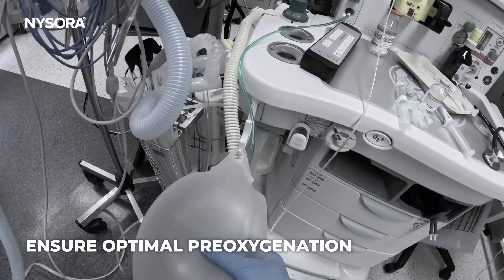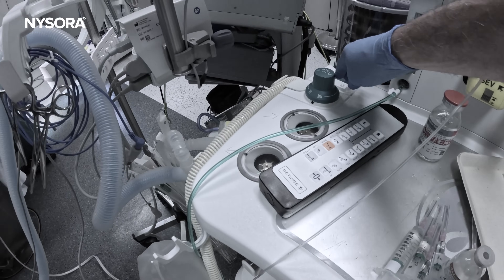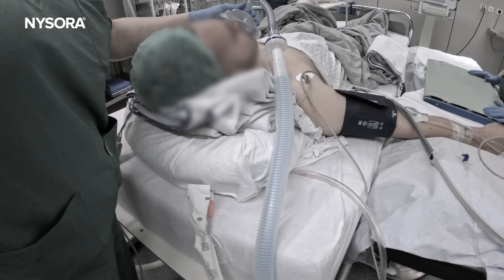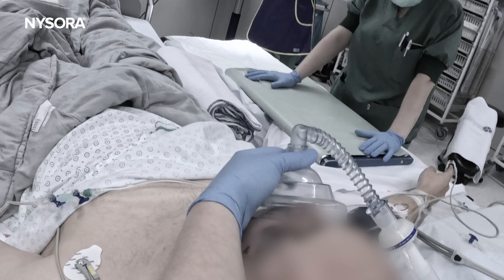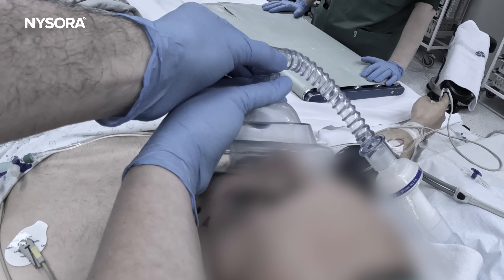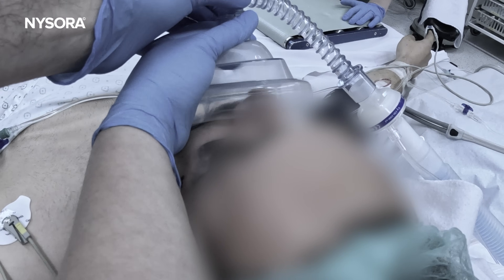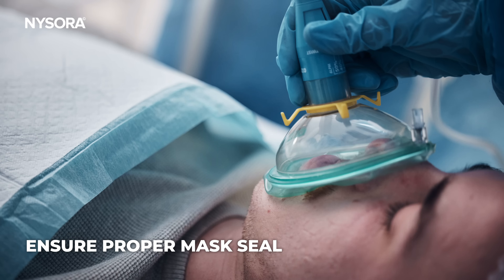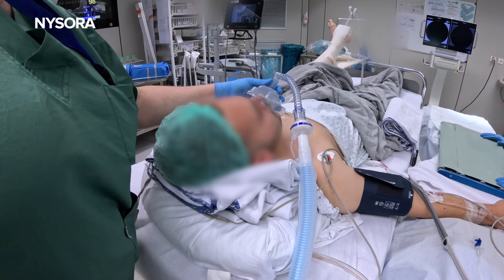We need to ensure optimal pre-oxygenation before intubation. Many practitioners think that applying oxygen through a mask automatically provides 100% oxygen, but this is only true if you apply a tight face mask fit. Any leak around the mask introduces room air, reducing the oxygen concentration the patient receives. So make sure you have a proper mask seal, especially in emergency situations like this.